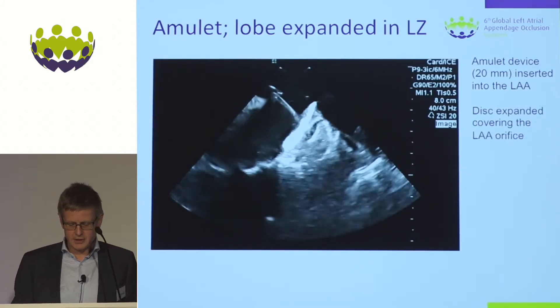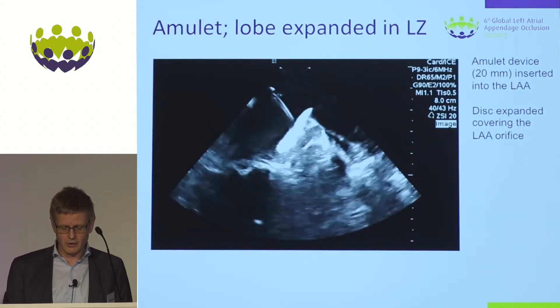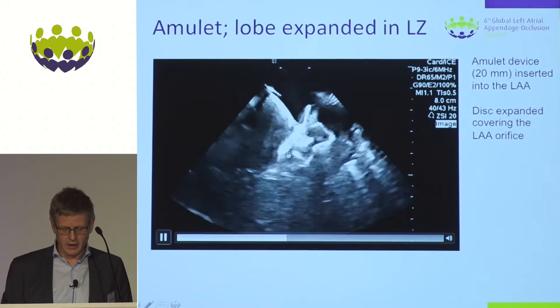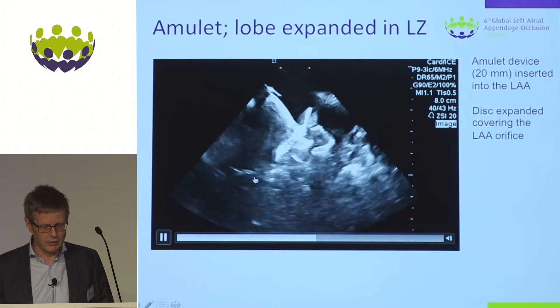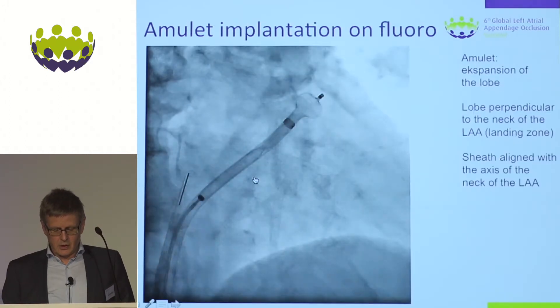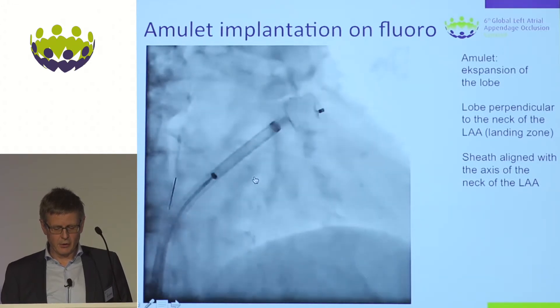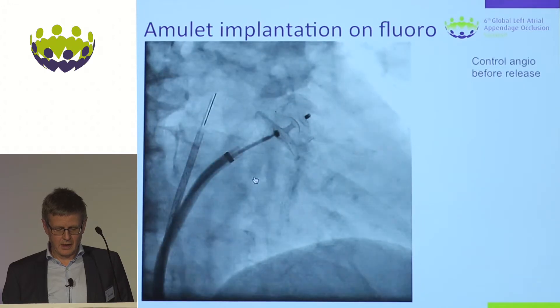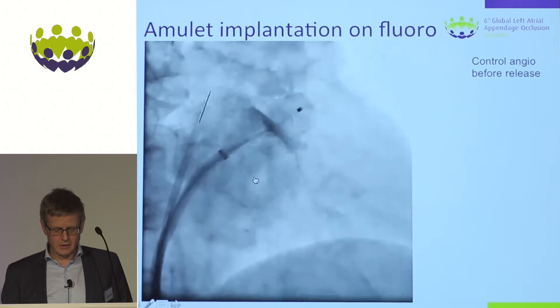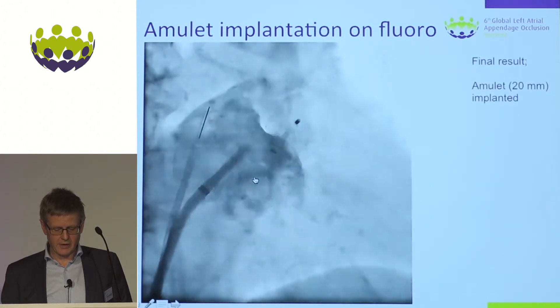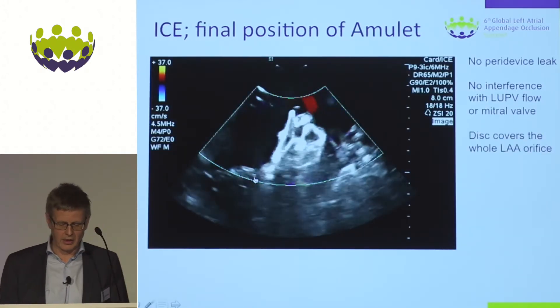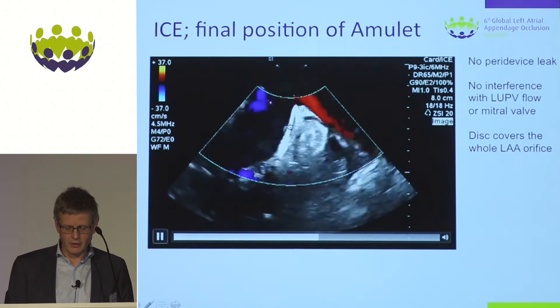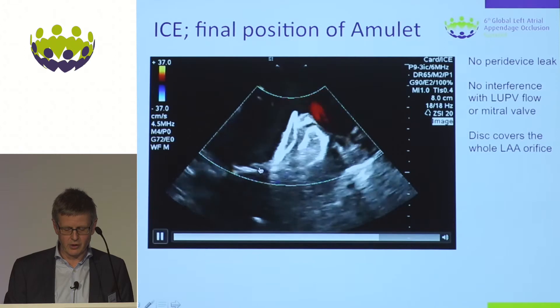The disc of the device is then exposed. In this projection it covers the whole orifice, extending all the way up to the upper pulmonary vein ridge and maintaining good contact with the left atrial wall, with no interference with the mitral valve. Fluoroscopy confirms lobe and disc expansion, and a control angiogram is performed before release. The final result on ICE shows the lobe distal to the circumflex, the disc covering the whole orifice, no interference with the left upper pulmonary vein flow, and no interference with the mitral valve.